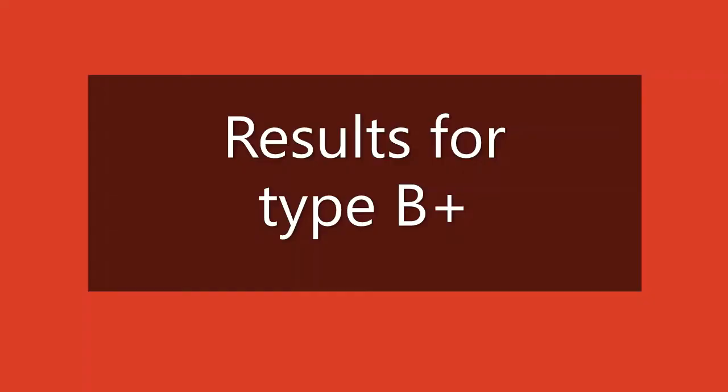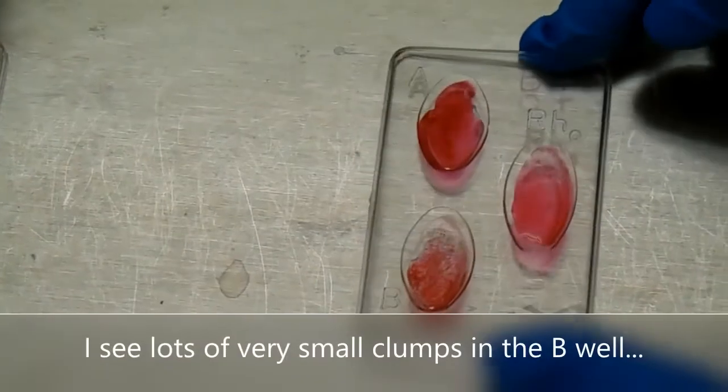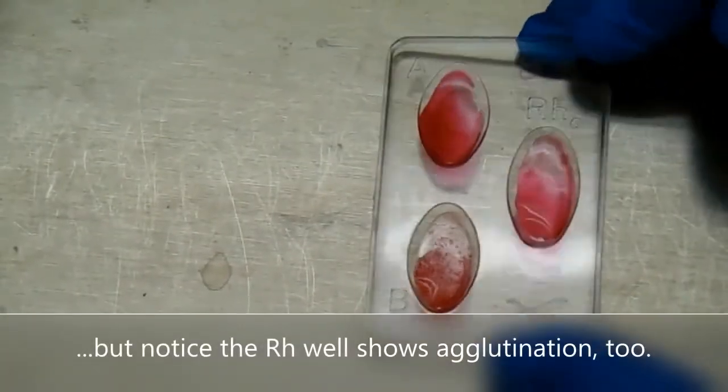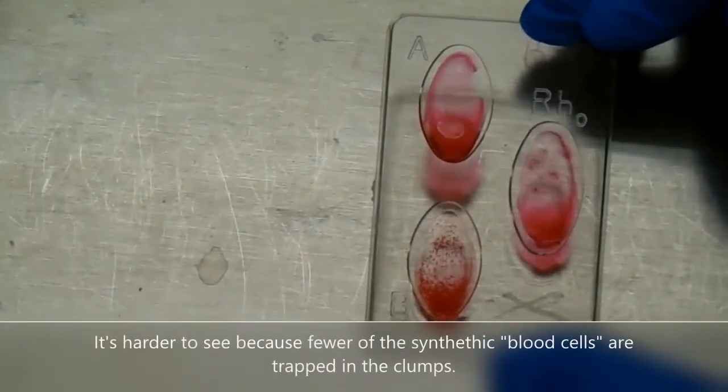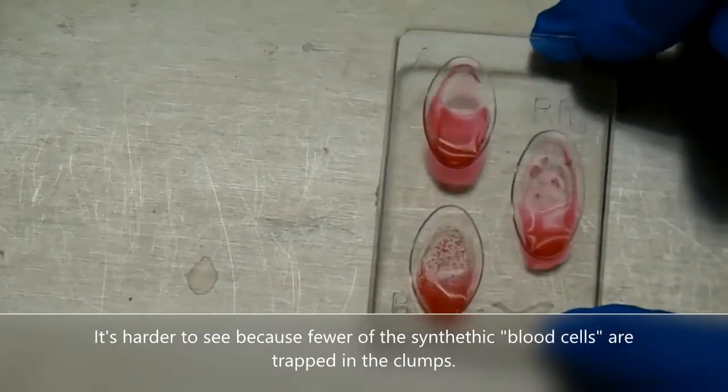Results for type B positive. I'll tilt the tray back and forth. I see lots of very small clumps in the B well, but notice the RH well shows agglutination too. It's harder to see because fewer of the synthetic blood cells are trapped in the clumps.